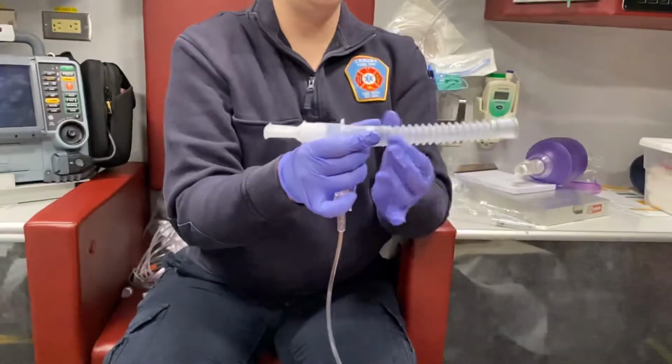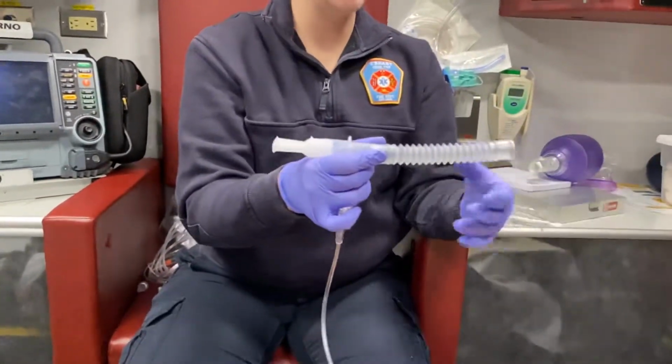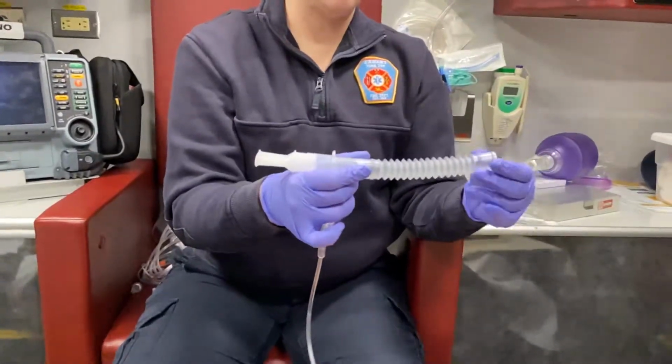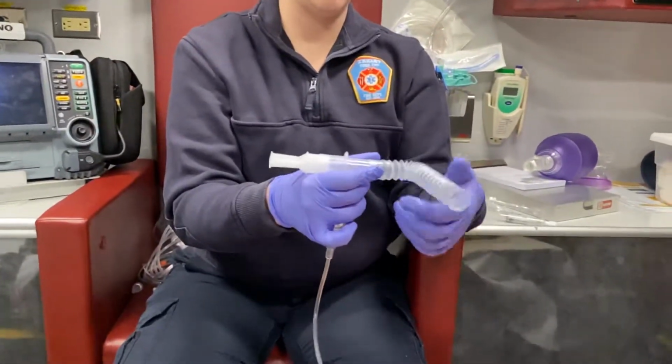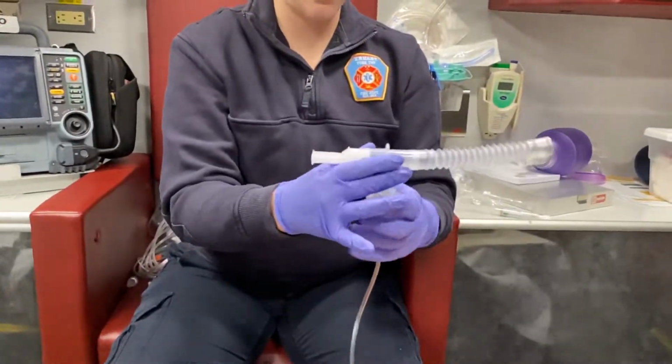This takes the patient's exhale and it brings it away from their face, because as you see, it'll create a mist, and we don't want that blowing directly back in their face. You also don't want it blowing on you, so you can actually kind of turn this away from you so you're not getting that patient's exhale into your face.